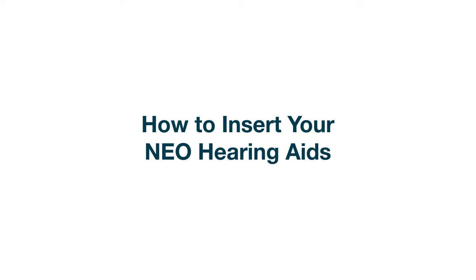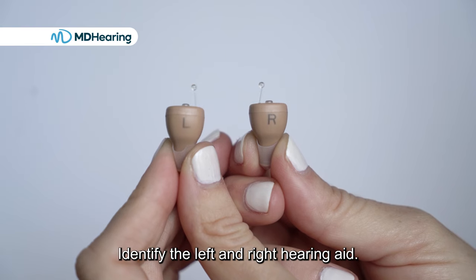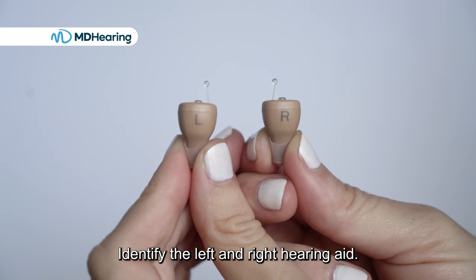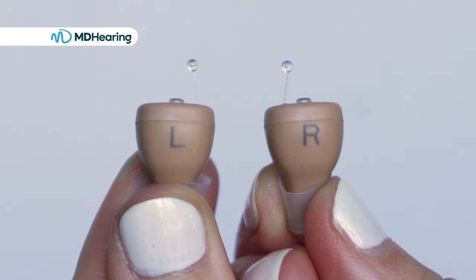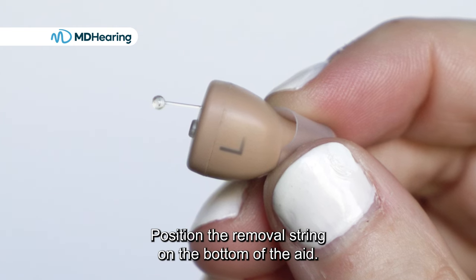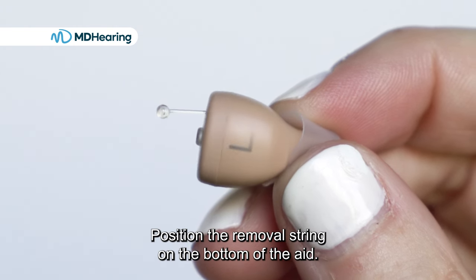How to insert your NEO hearing aids. Identify the left and right hearing aid. Position the removal string on the bottom of the aid.